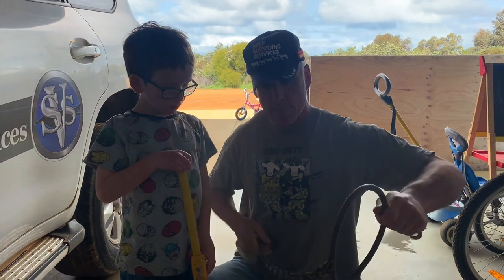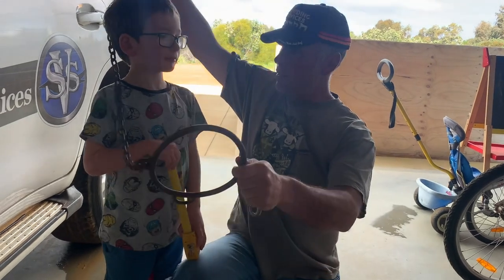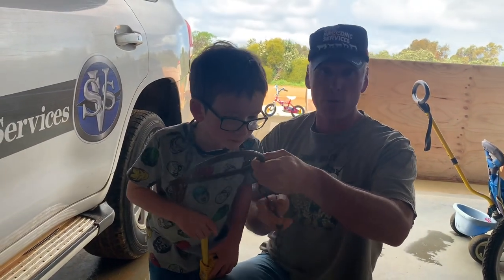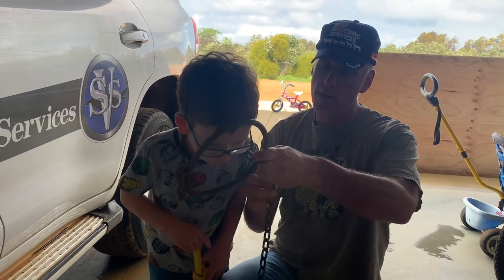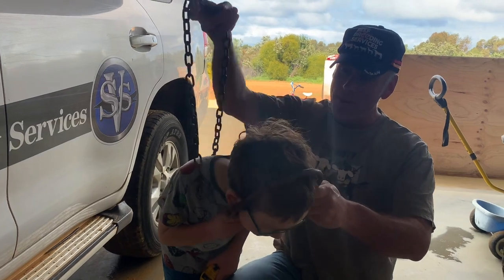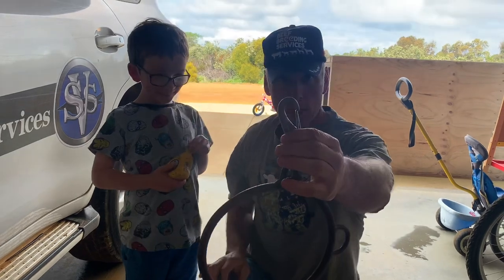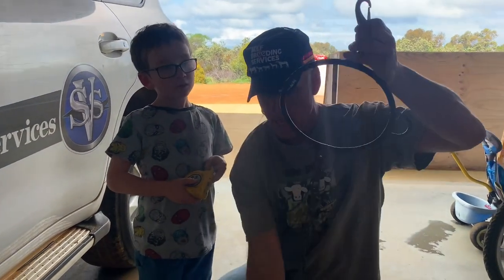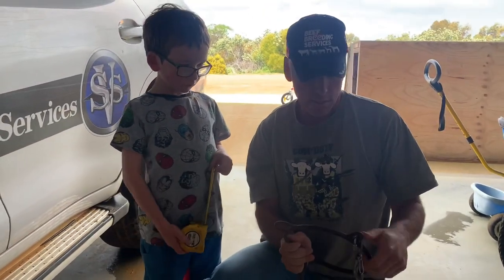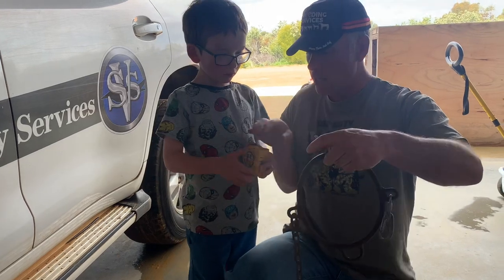The way it works is we just carefully introduce that over the nose of the animal, and then the back part of the halter goes back around behind the poll — so behind where the horns would be, in the back of the head — and then we clip that under there. We've got pretty good control of that animal. A really important aspect of it is this hook has to be really strong, and then a good solid chain that's not going to break. So I've got confidence that I'm not going to get hurt and that I'm not going to hurt the animal.